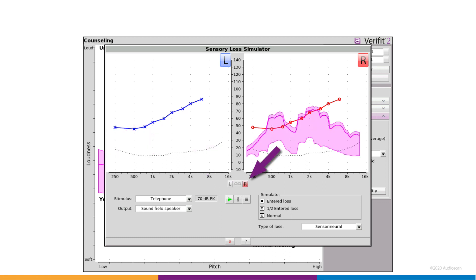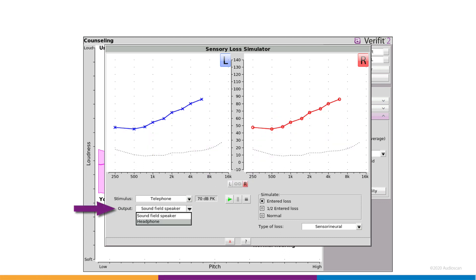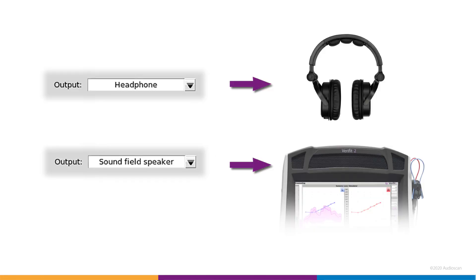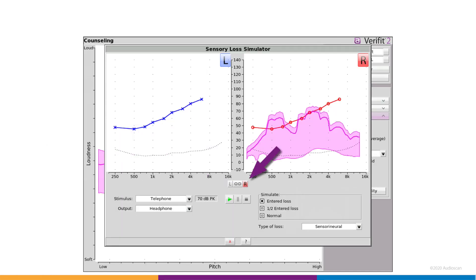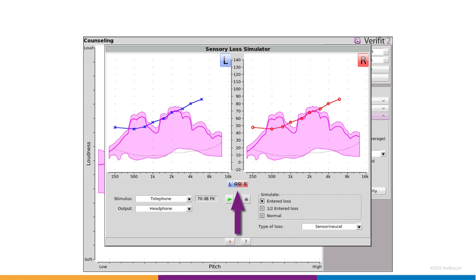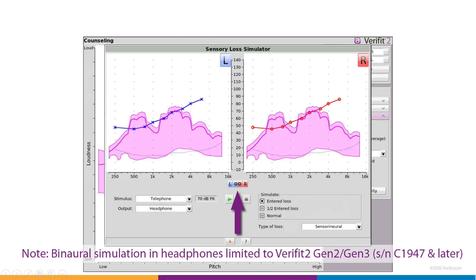A selector in the center allows for left and right selection. New also is the output selector. This allows the simulation to be directed to the binaural monitor headset instead of the internal REM speakers. When the headset is in use, the ear selector now enables you to toggle between left, right, and binaural modes. Please note that the binaural mode in the headset is only functional on Verifit 2 Generations 2 and 3, serial numbers C1947 and higher.